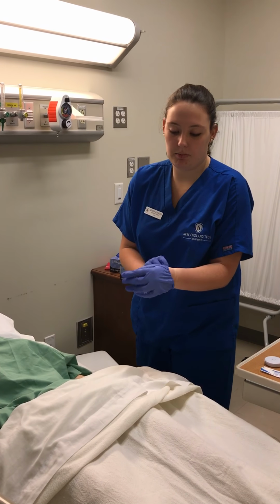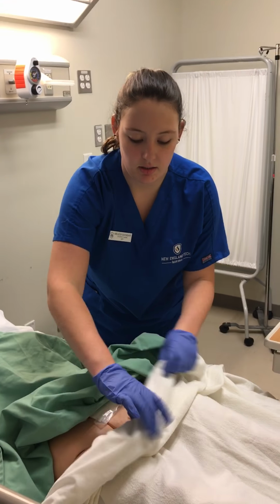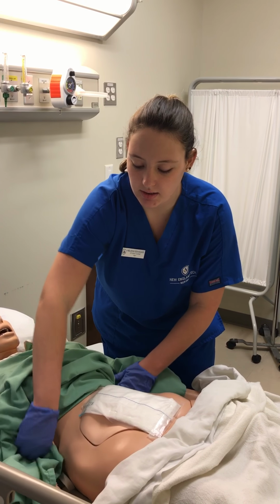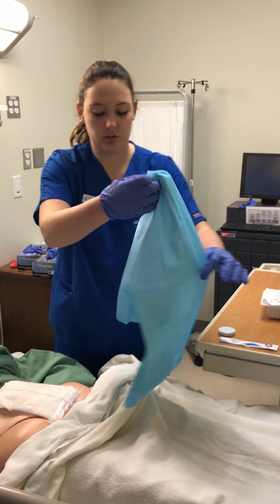All right. I'm going to do my best just to expose the needed area, just the area, trying to keep privacy as much as I can. I'm going to put my chuck down for trash.